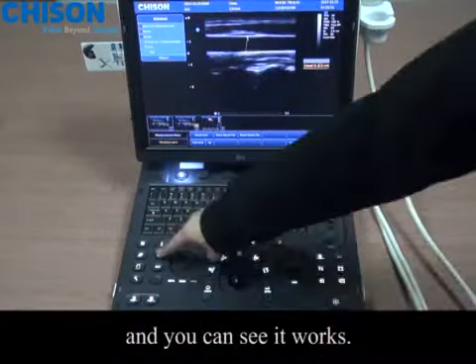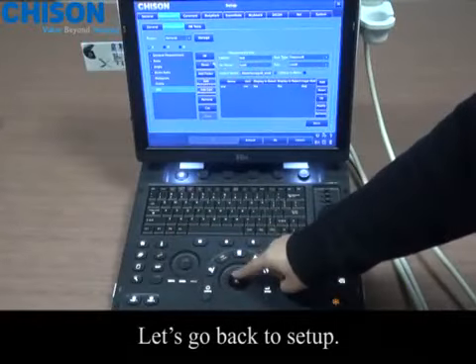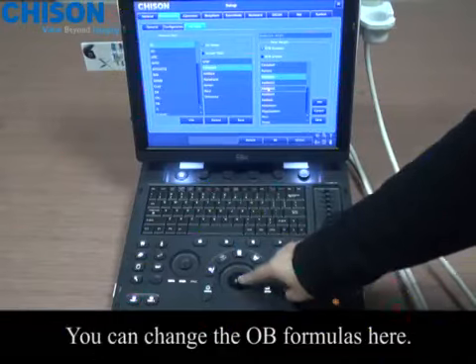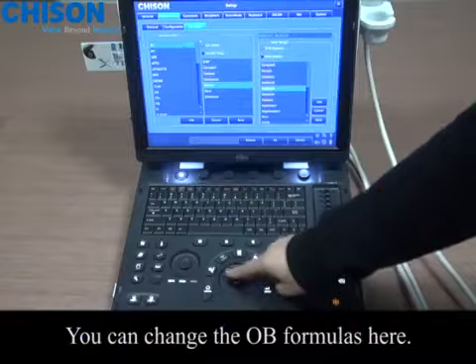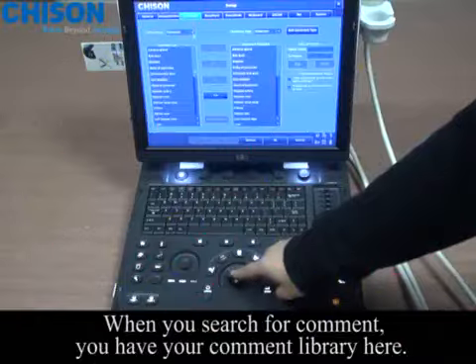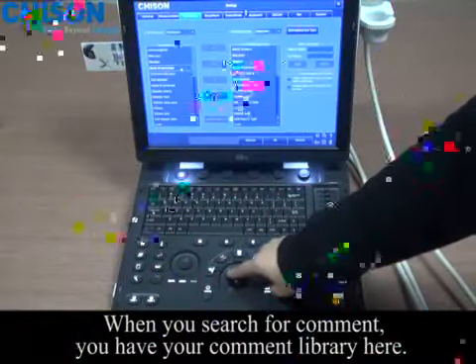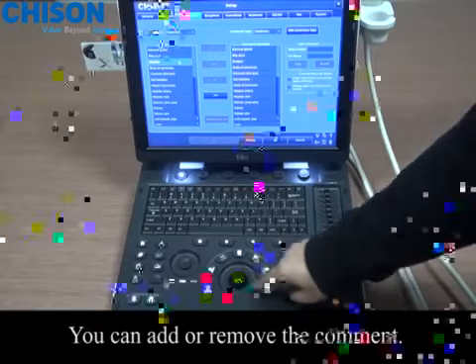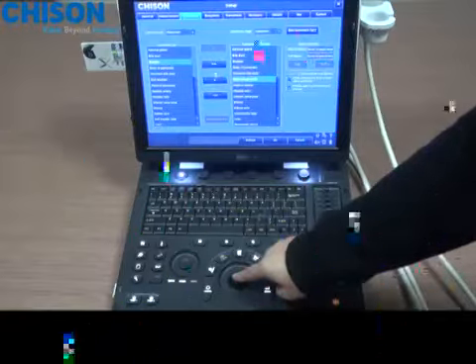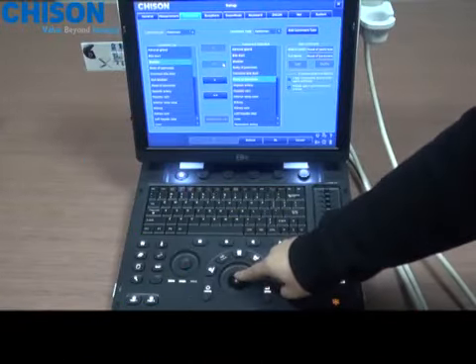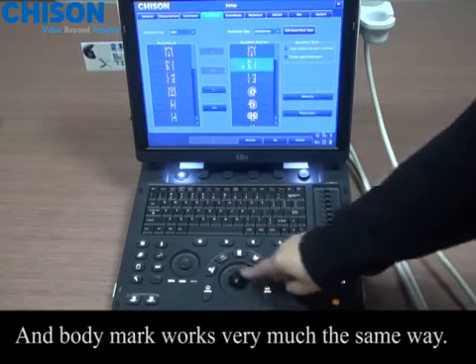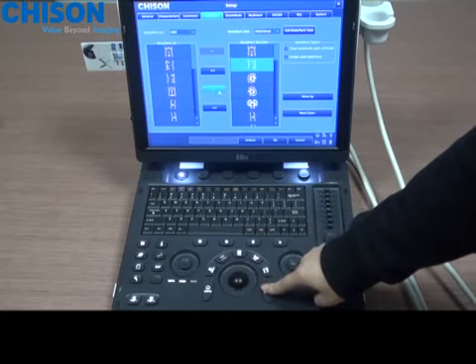Let's go back to setup — you can change the OB formulas here. When you search for comment, you have your comment library where you can add or remove the comment. The body mark works very much the same way.